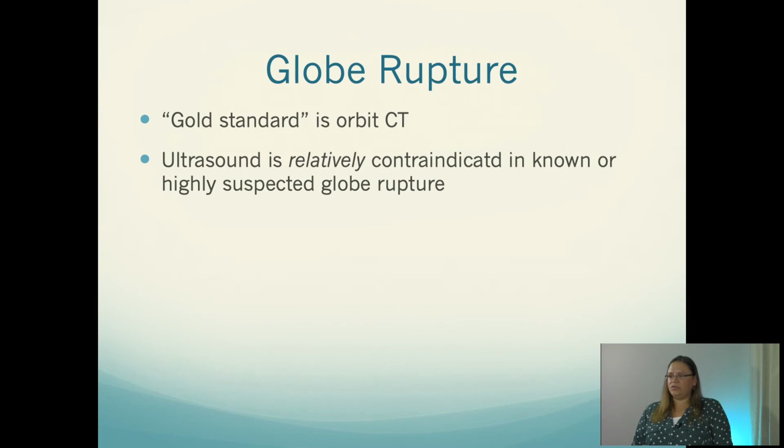All right, gold standard is orbital CT for globe rupture. And remember that ultrasound is relatively contraindicated. So especially if you're working under an attending, make sure you talk with the attending first before doing the ultrasound. And if you decide to proceed with the ultrasound, do it very cautiously. Make sure you're not putting any pressure on the eye at all.